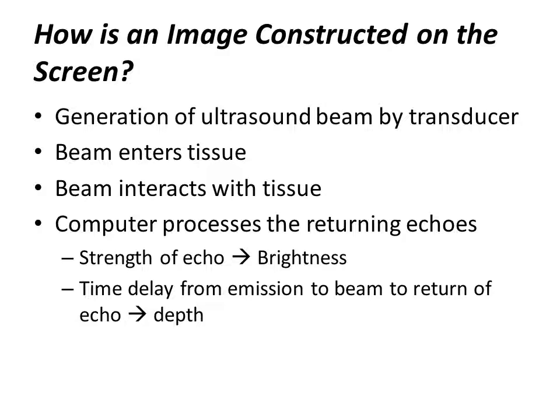So if the rays come back from a tissue relatively quickly, then the machine judges that tissue to be superficial and treats it as such. When the reflections from the tissue are received with a delay, the machine assumes that tissue is deep, and that's the cause of the delay for the ultrasound coming back to the screen. This principle is going to be important when we talk about deciding the depth that you want to measure during your ultrasound scanning of a tissue, and how important that is. So these are some of the basic principles of ultrasound generation and projection.